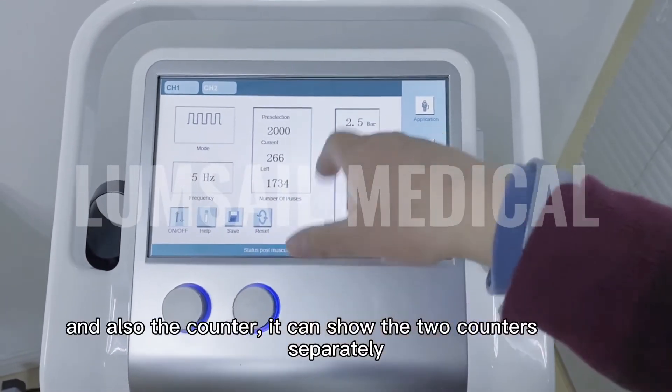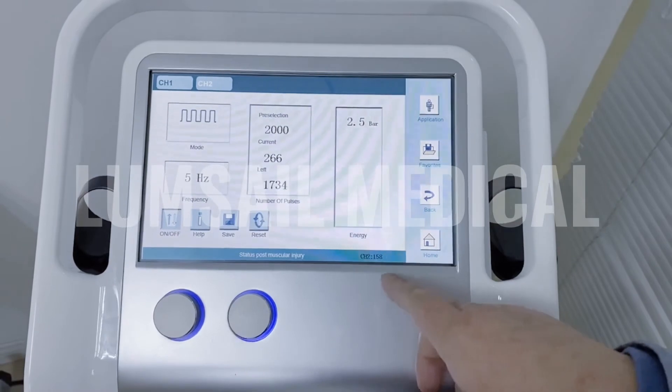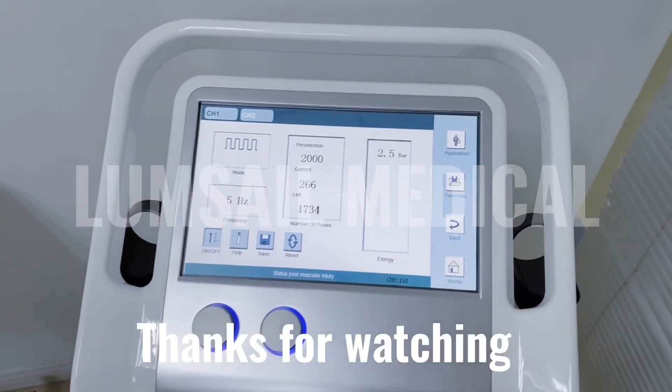Also, the counter can show the two counters separately. For example, if you go to the channel 1 menu, it will show channel 2 at the bottom and the channel 1 menu at the top, so that you can see the two handpieces' counts at the same time.